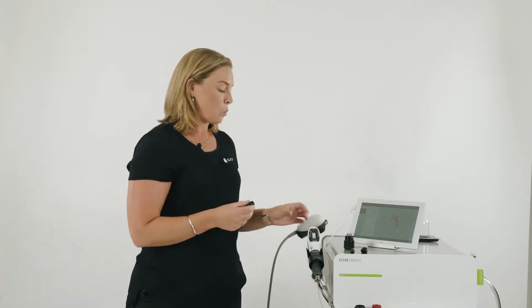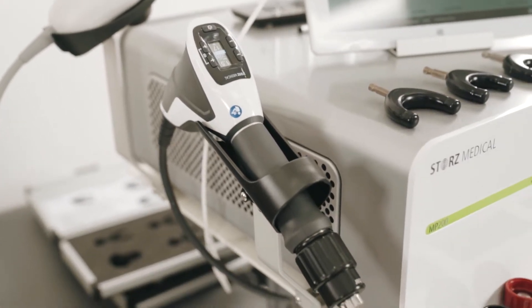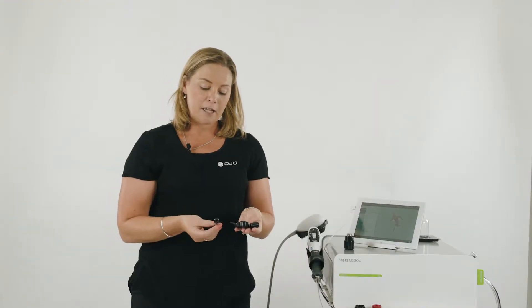The next accessory we're going to talk through is the peri-actor. These transmitters are compatible with the Stortz Medical Falcon handpiece of the radial shockwave machine. You can see here we've got four different shapes of the peri-actor, and these are used in areas of the body where there's a high amount of fascia. Depending on the area that you're treating will depend on which transmitter you choose to use.